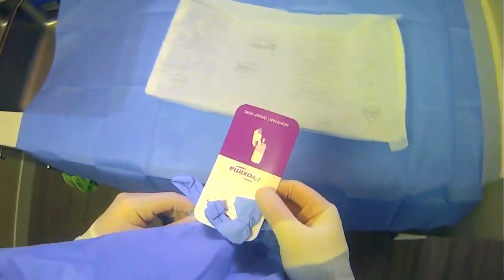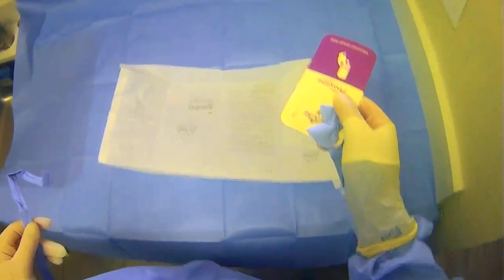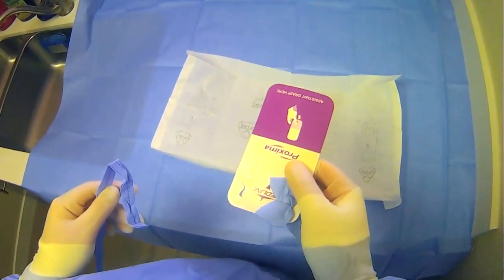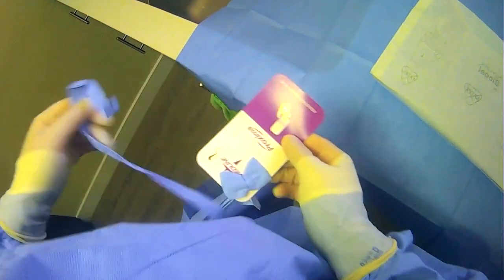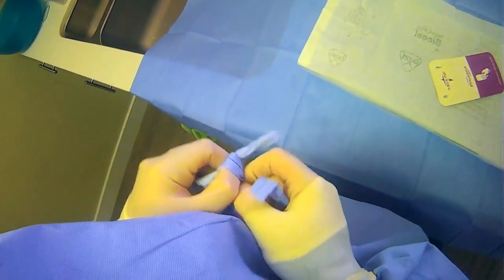You have your gloves on, you have your gown on, and then there's this little thing right here which you will pass. Basically, you will take this off like so, pass this to someone else, and spin around, and this will help you tie yourself back in. As you get more skilled, you can pass this back to yourself like so without contaminating anything. But whether you pass it to yourself, or pass it to someone else and spin around, you'll tie the final strap in here, and you will be ready to go.